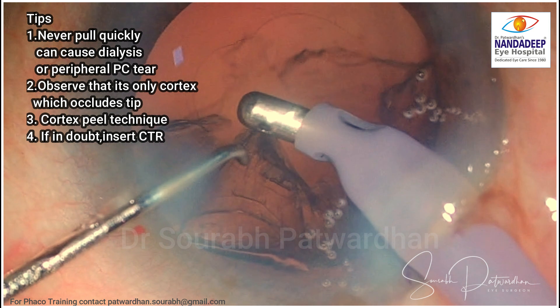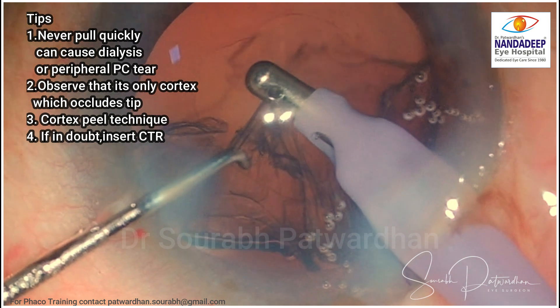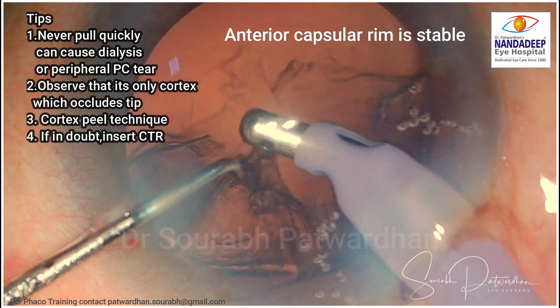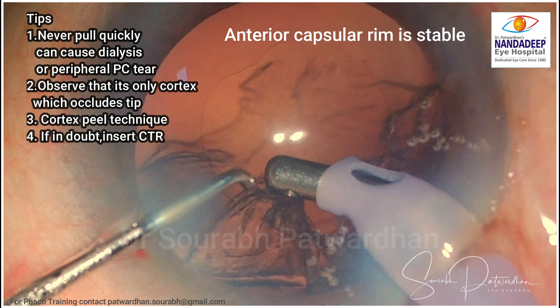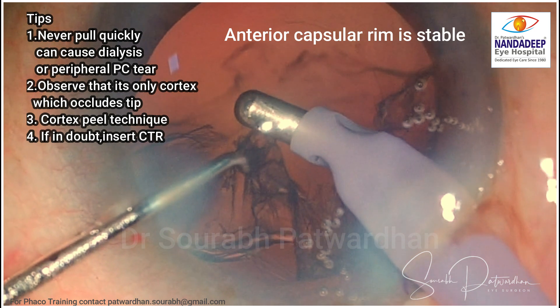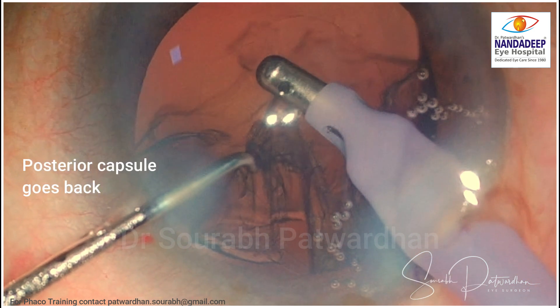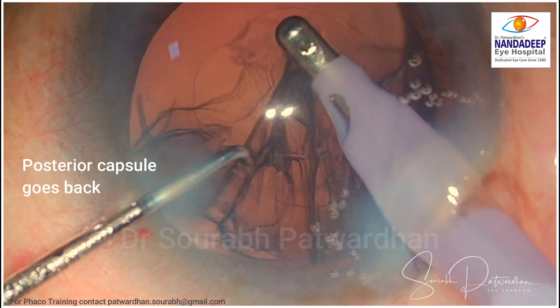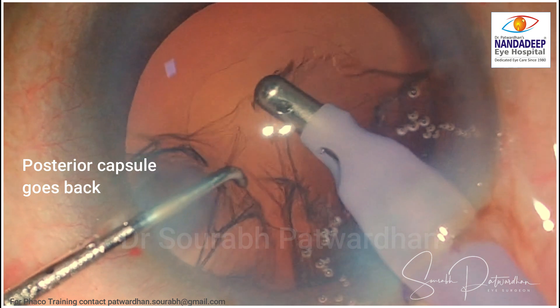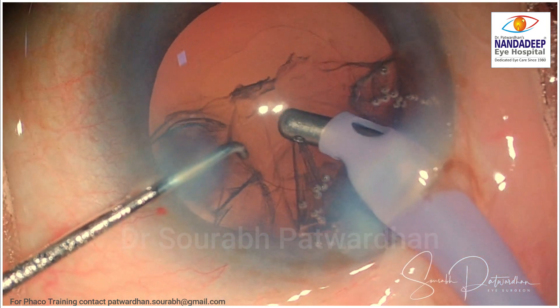If you are careful you will be able to remove it without a CTR as well, though if you put a CTR sometimes cortex removal may become a little bit difficult. Watch again — the anterior capsule rim is very stable, which gives me assurance that the anterior zonules are intact. When to pull this cortex out? The moment you find that the posterior capsule is going back, you can pull the cortex out completely. So just be watchful and careful while taking out this cortex. Of course putting a CTR is a great idea.